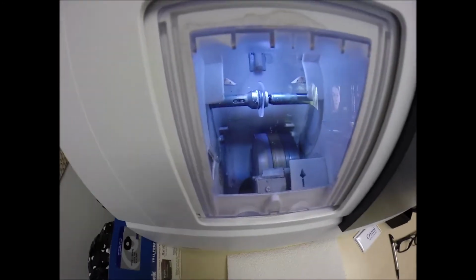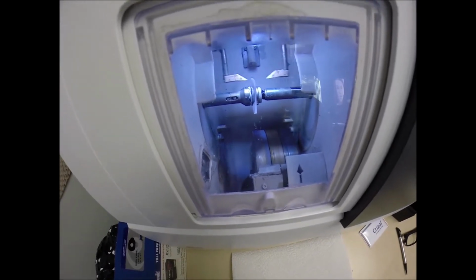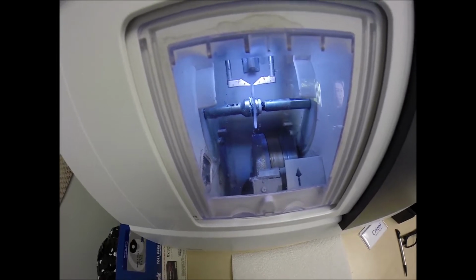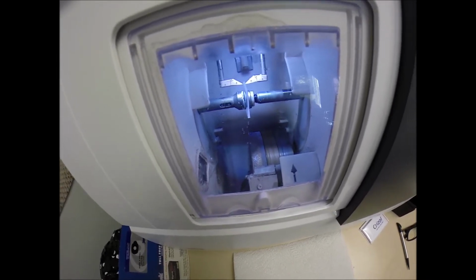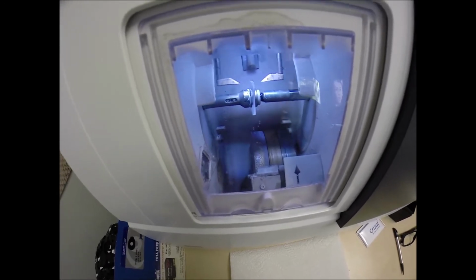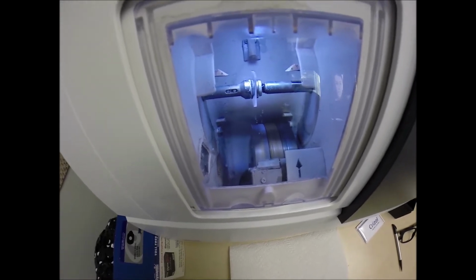Now, if you notice your lens is completely flat all the way around, if I were to take it out, it would stand up on the counter just like a nickel. The machine is double checking itself to know where to place the bevel, again for the least amount of edge thickness to be shown, of which I doubt you'll have any. But speaking of protection, you have the Crizal Avance, which is 3 features in one.